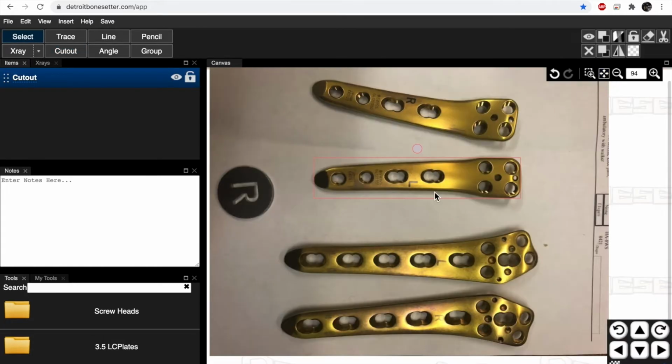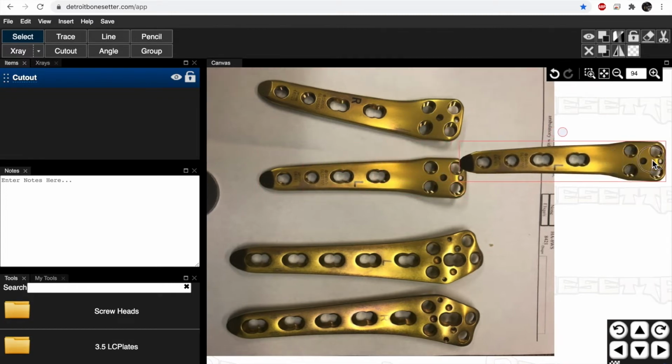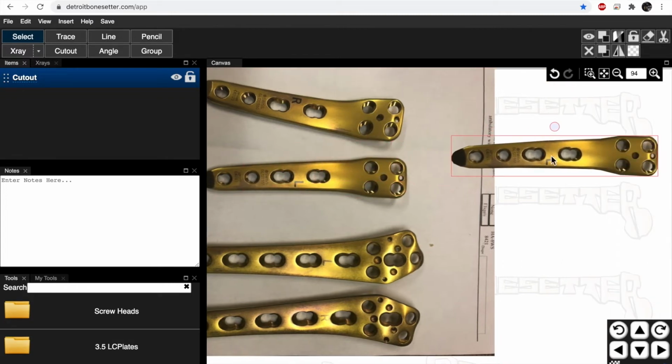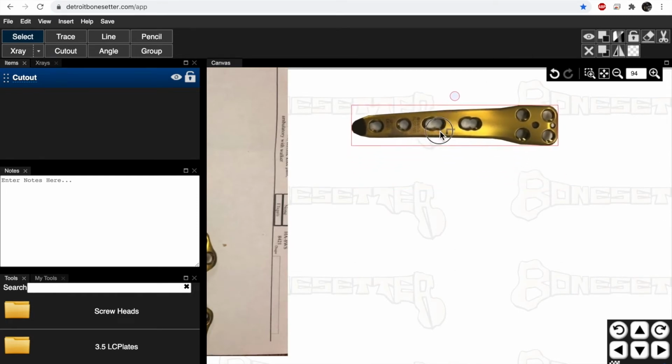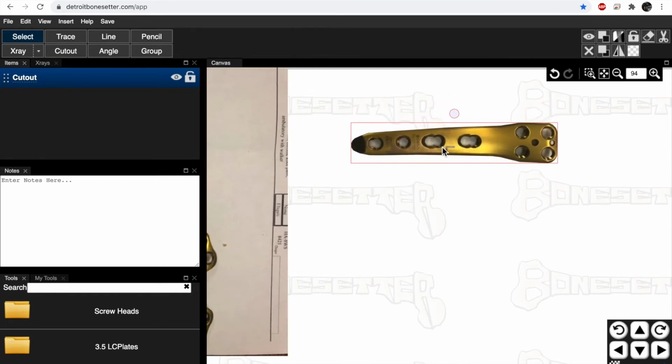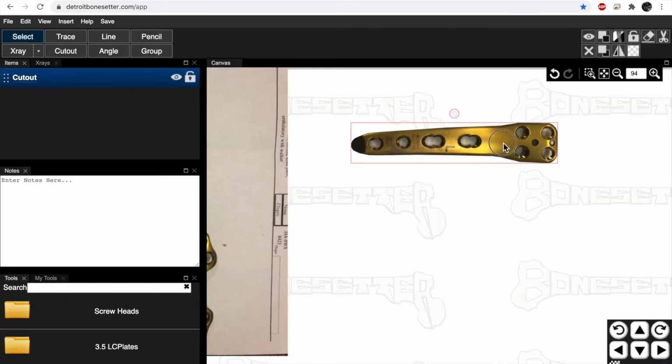And so if I bring this back, I can take this piece and bring it over. And I'm going to move it way over. And here it is. Now, you can see where the holes are. You can't see through it. But we have a method of doing that, and it's erase from cutout. It's this tool here. So if I pick the cutout, so I've selected it, it's got the ball and the red around it. Now I pick the erase tool.